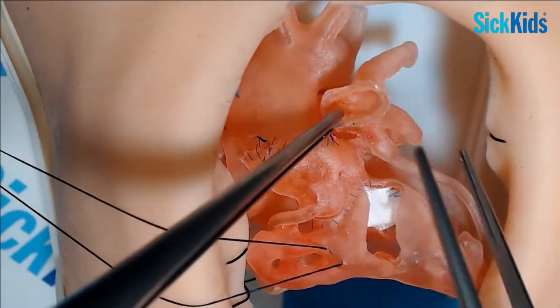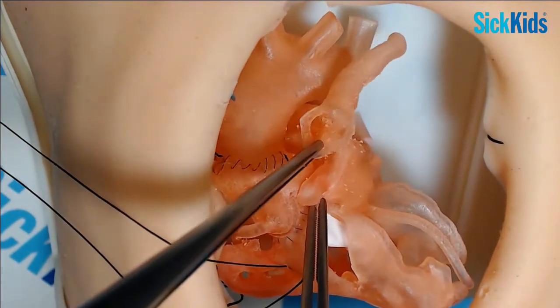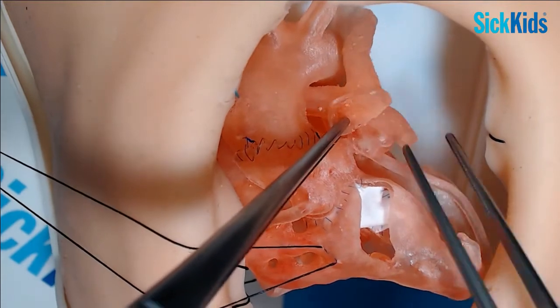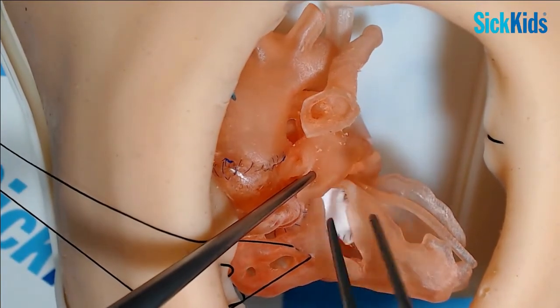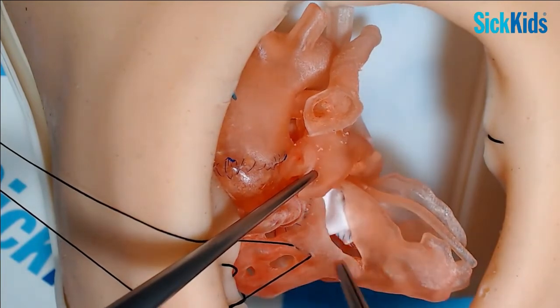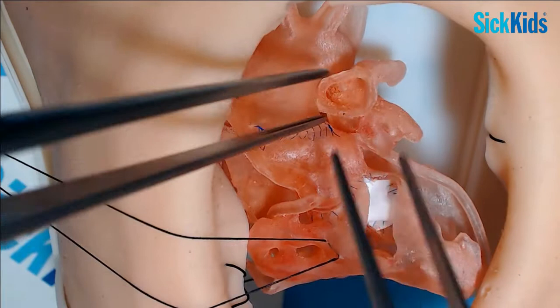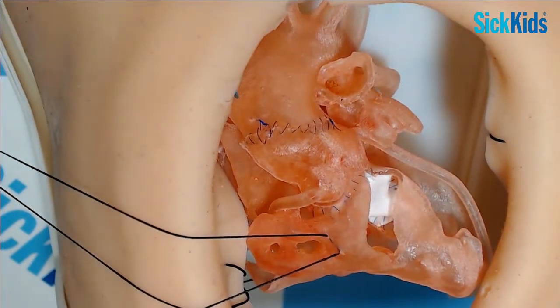But you can only do it if the pulmonary arteries are nice and big and they're not under tension. And I think the other thing that people have described is bringing the left appendage into position, and you sew the pulmonary arteries to the left appendage, and then you sew the left appendage to the ventriculotomy, and then patch over the whole lot. So those are other alternatives if you haven't got a nice conduit. But as I say, we've got the conduit today, so you can use the Gore-Tex tube.